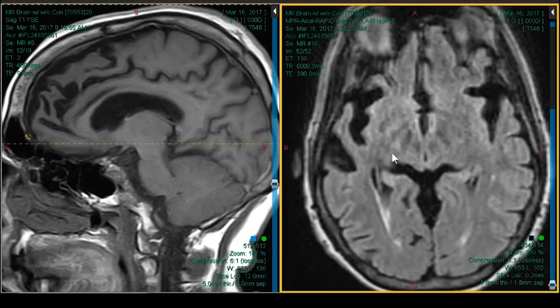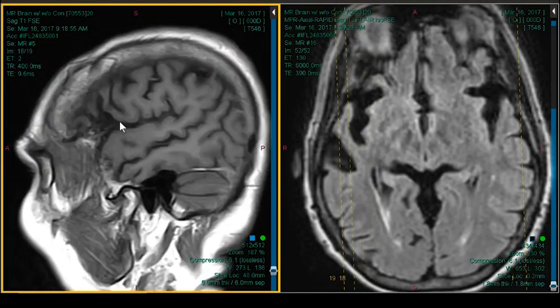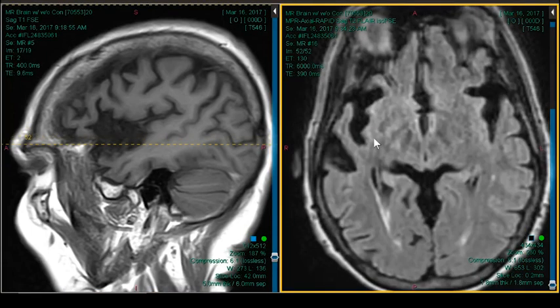Let's see if we can show it. Let me scroll the sagittal here. And maybe it gets a little more than 1/3, but there is knife blade atrophy. It stops dead right there. So it fits really nicely, unfortunately, for Pick's disease.